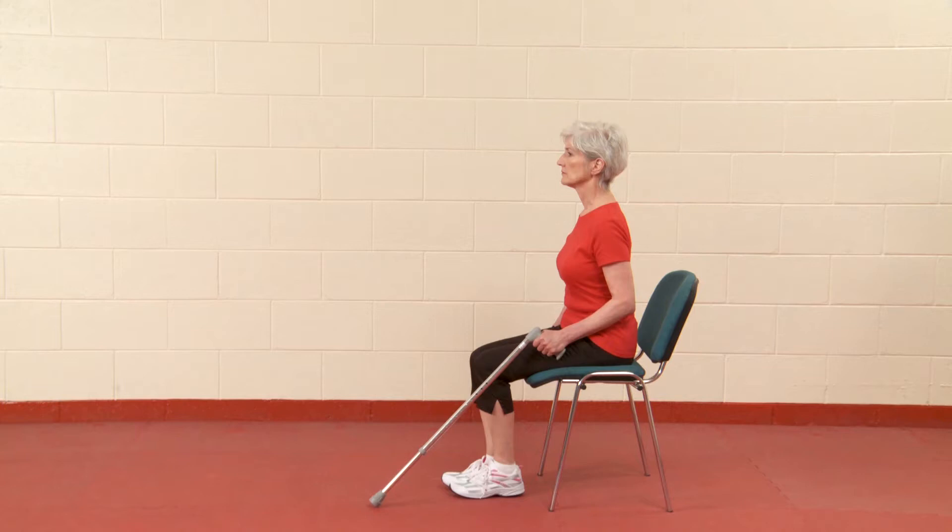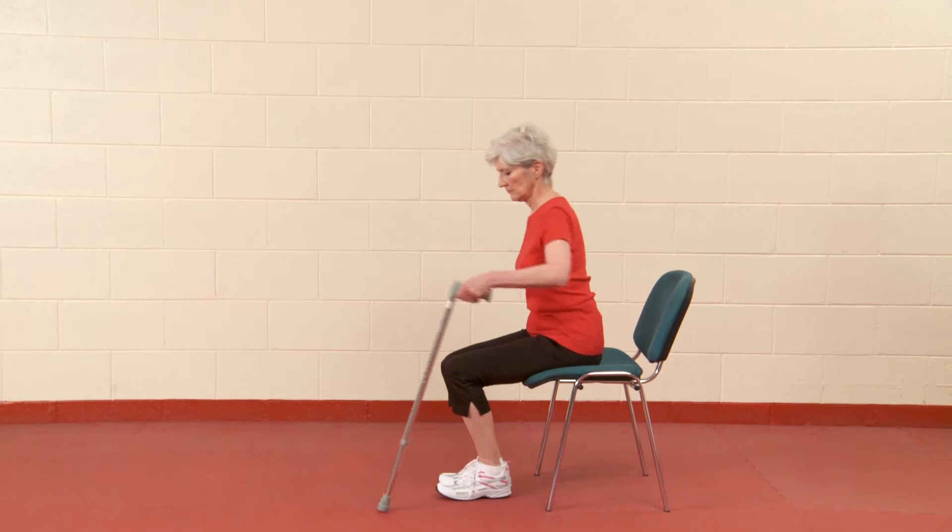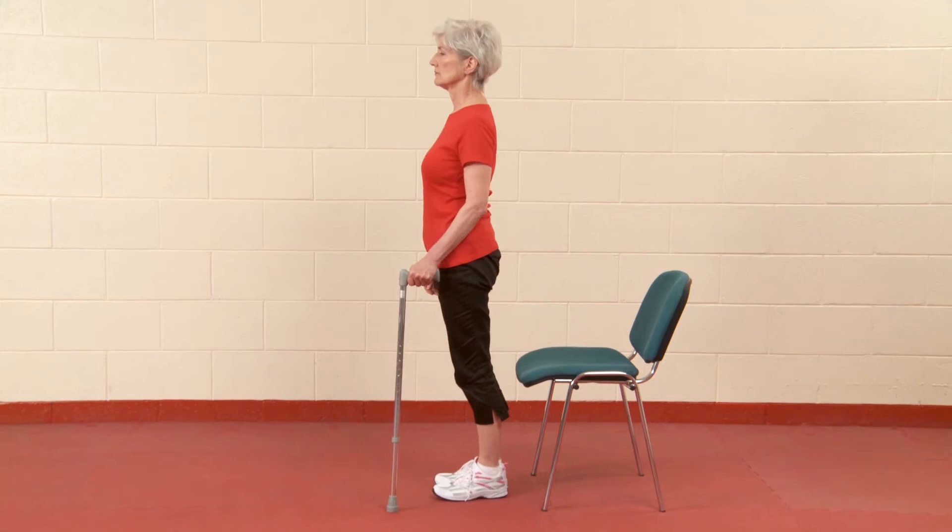Move to the edge of the chair. Place the walking stick firmly on the ground. Lean forward and put your weight through the walking stick. Push through your hand on the chair. Stand up. Get your balance.